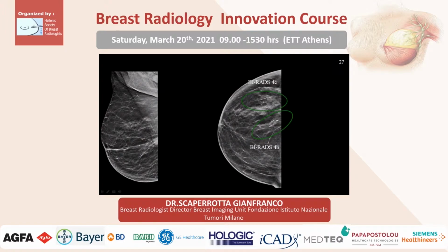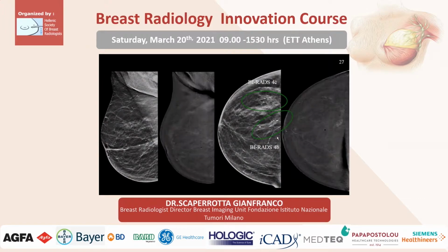We think this calcification is typical malignant calcification, and in fact there are 4C for us. There is some problem to understand because it's near the calcification, and so I think there is the possibility of liponecrosis calcification. In this situation it's possible to see the enhancement in two different sides, and so this is a particular diagnosis.